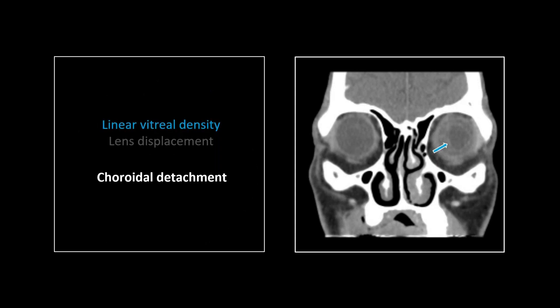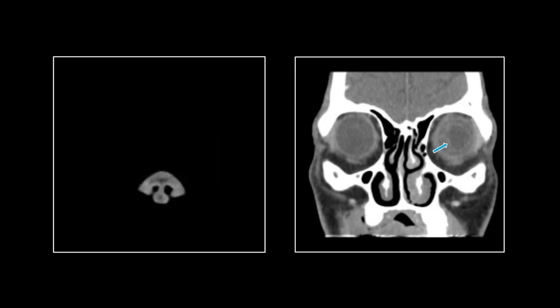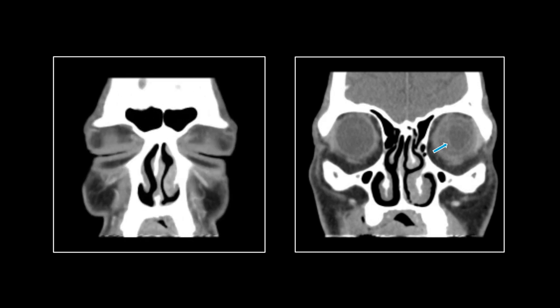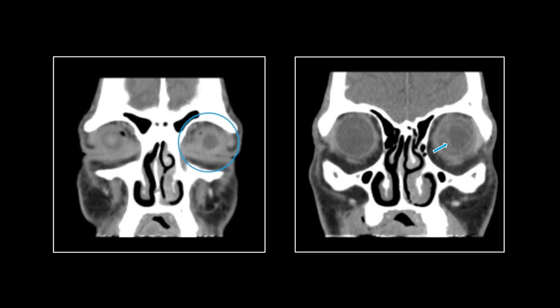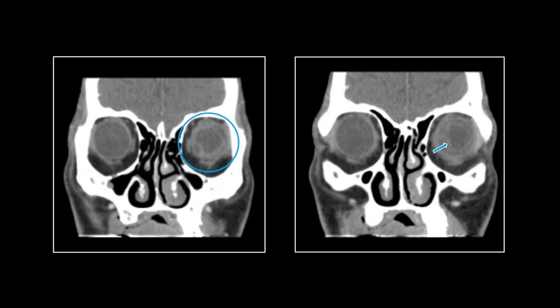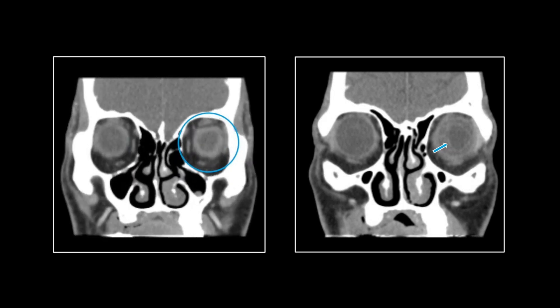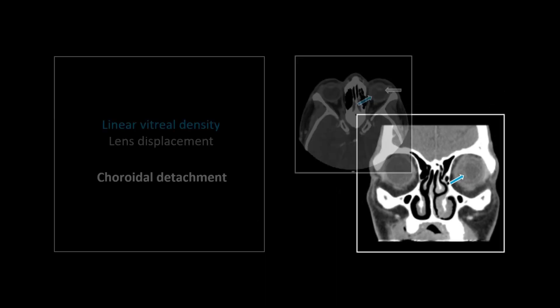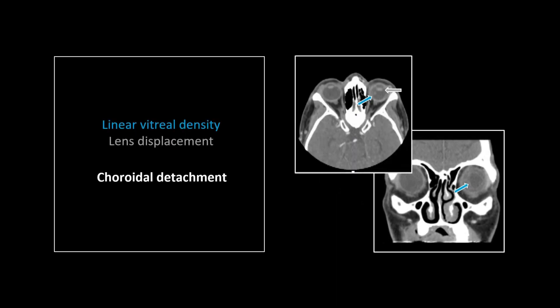Here it is on the coronal — a really nice view. You can see it's separated from the inside of the globe all throughout. So that is a choroidal detachment.